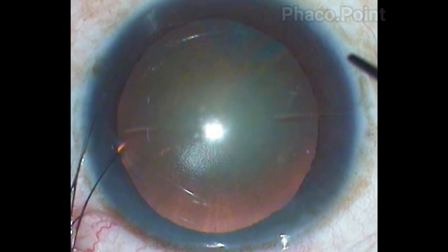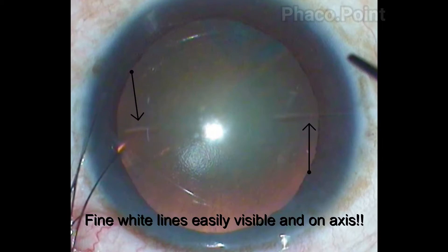This blade leaves behind thin, fine white lines that are quite easily visible under the operating microscope, and they are bang on axis as well.